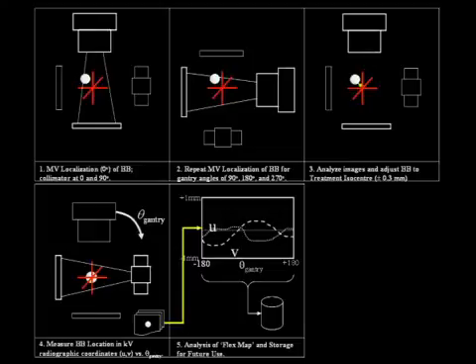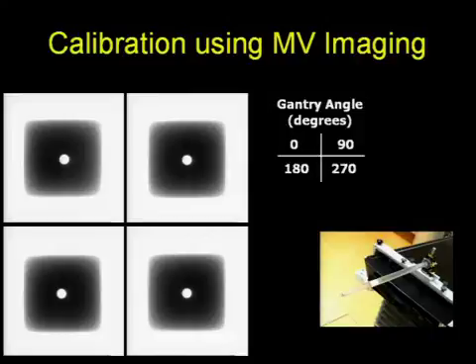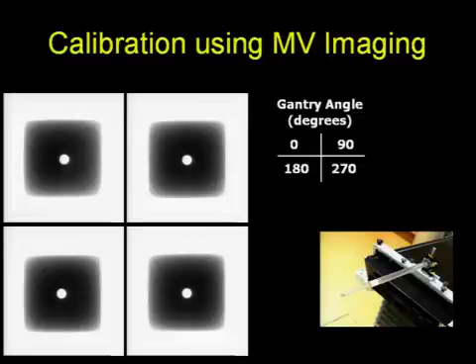And these calibration Flexmaps are then recorded onto the hard disk of the system and are subsequently used to correct clinical projections and ensure calibration, that the relationship that I talked about between the MV and image guidance system isocenters is known and corrected for. So again, this is a cartoon showing images obtained for cone beam CT calibration.